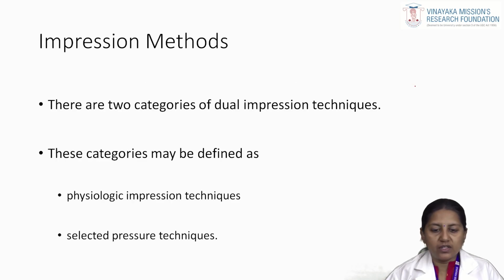Now we will move on to the impression techniques. There are two categories of dual impression techniques. They are defined as physiologic impression techniques and selected pressure techniques.